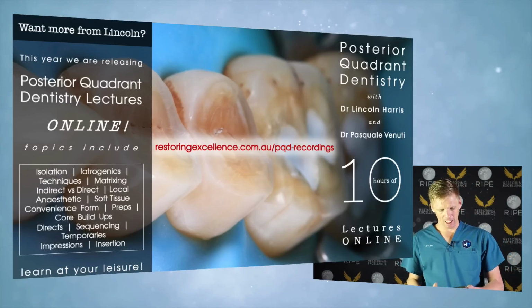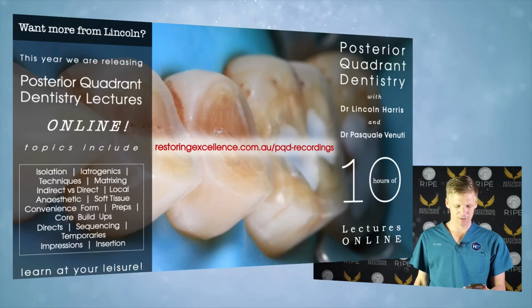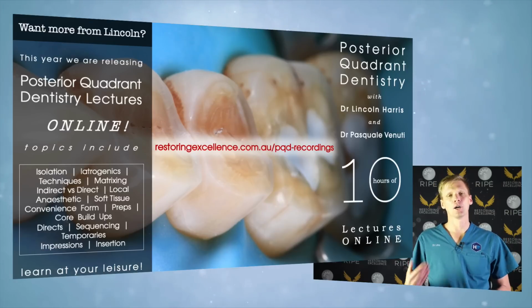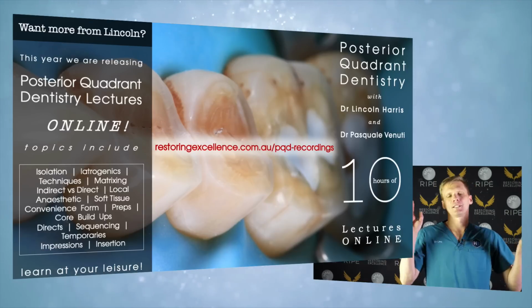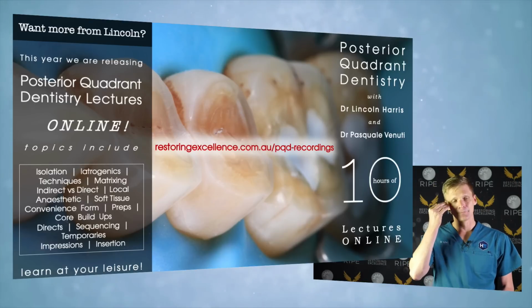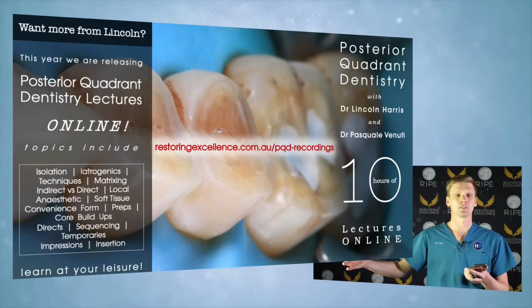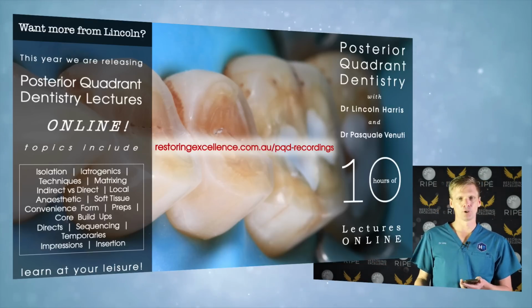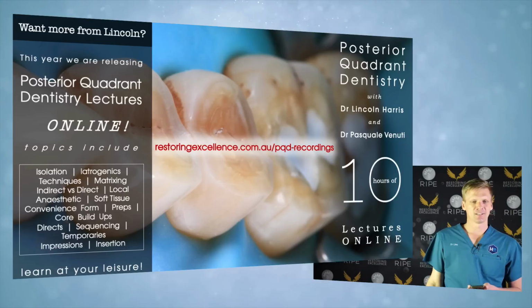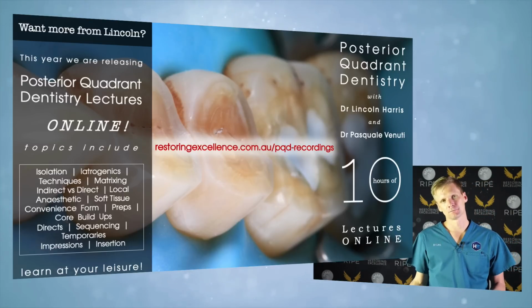Okay, this is from Jordan. I know a few prosthodontists that blow air with their triplex on light body once they have injected around the margins to ensure the light body is well within the sulcus. Have you tried this and what are your experiences? I find that it makes no difference. You're hopeful, okay? You're living in hope. You're hoping that the silicone will go down there and it won't. If you want silicone to go down into the sulcus, you need to push the gingiva away from the margin of the tooth. Then the silicone has enough room to go down and you don't have these whole problems with wetting or contact angle. So blowing air, I do it quite often because I live in hope too. I live in hope that one day there will be an easy way to take impressions, but there's not.